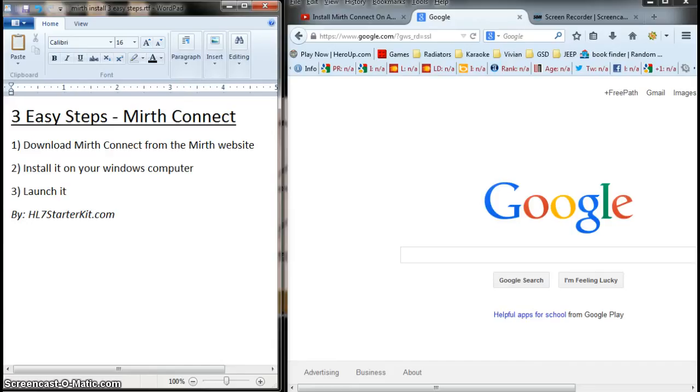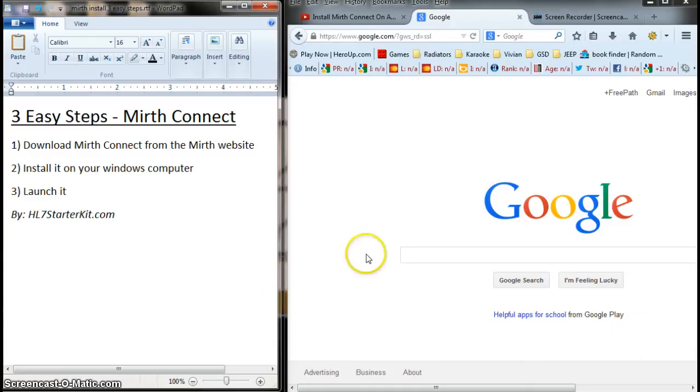So we're going to do this in three easy steps. First, we're going to download Mirth Connect from the Mirth website, then we'll just install it on your Windows computer, and then finally we'll launch it to ensure it actually works and the installation was successful. So let's go ahead and do that.